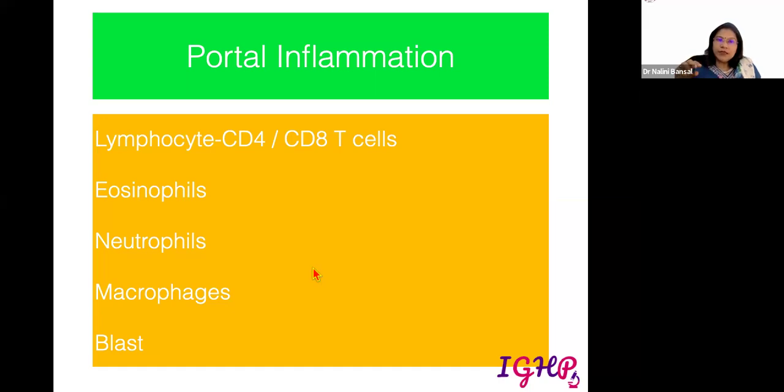Now, these blast cells are different from the lymphocytes because they are relatively larger in size as opposed to the normal lymphocytes which are seen in the infiltrate. Normally the rejection infiltrate is usually mixed in nature, with a component of all of these. When we talk of these infiltrates, as I said, there could be some eosinophils also within the infiltrate.